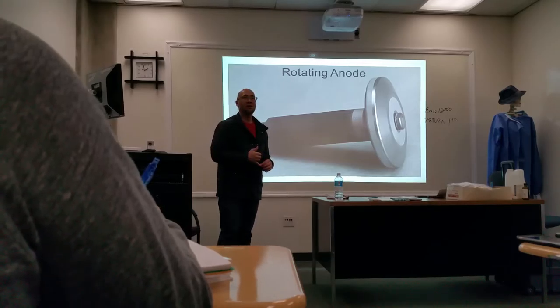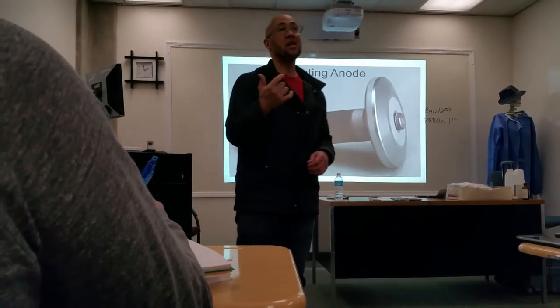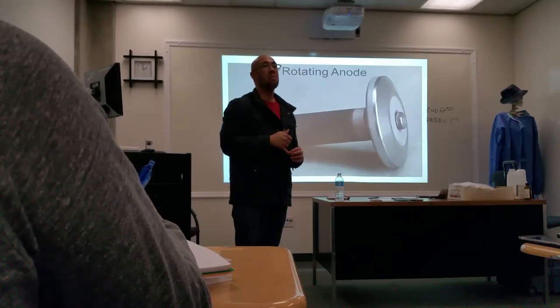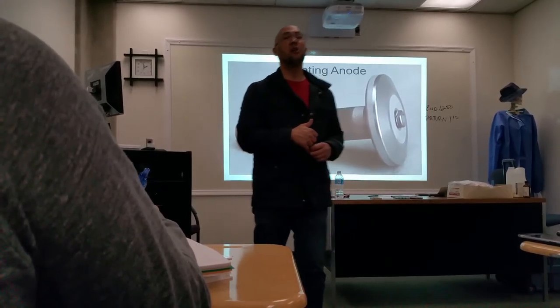Wouldn't that also reduce the amount of pitting because it's more even? Right, so if there is pitting and we don't catch it, is that what you're talking about? No, I'm just saying, by nature of the rotating anode, does it take longer to pit? Yes, it takes longer to pit. Longer tube life. Yes, longer tube life.